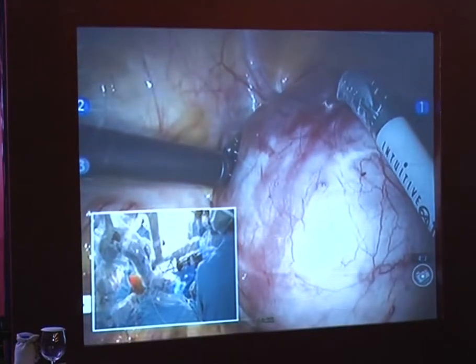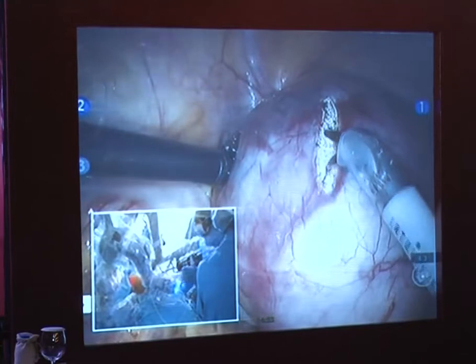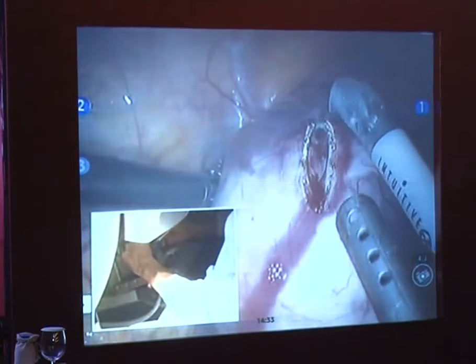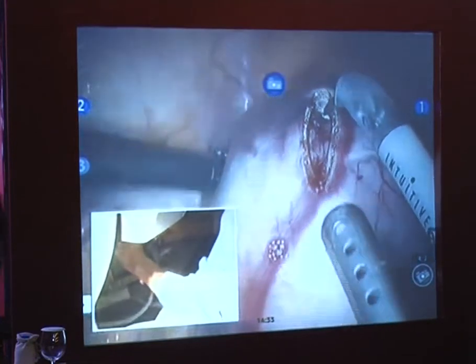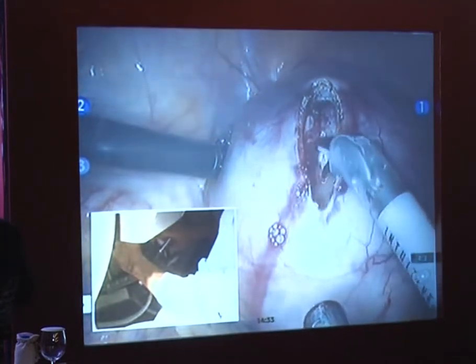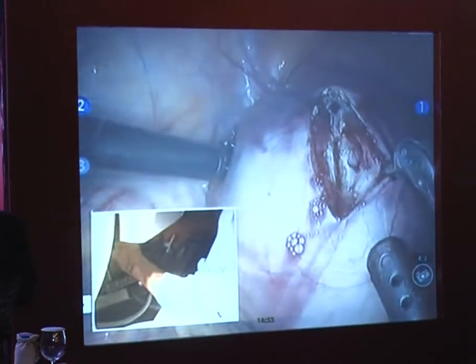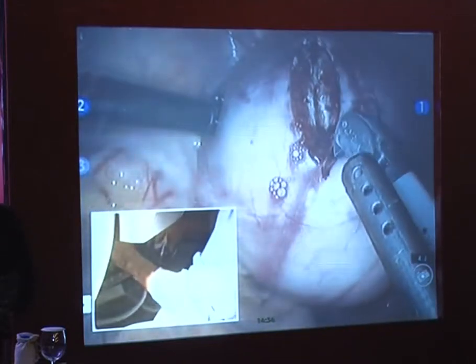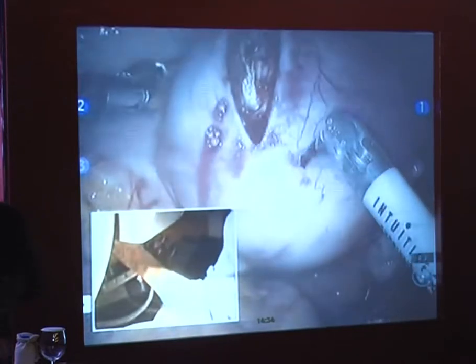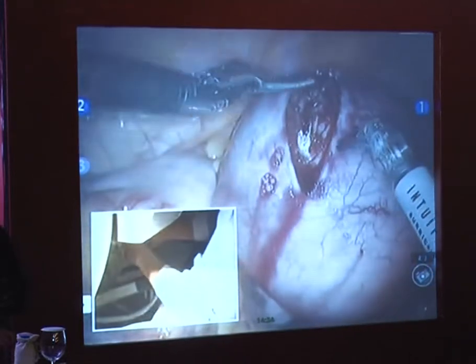Arnie, what are your power settings on your monopolar scissors, and are you using cut or coag? In this one, I'm actually using coag, but when you arc to the tissue like this and barely touch it with the scissor, it acts almost like cut, as you can see. And I'm staying away from the cornua here. And what is the setting on your monopolar? I usually like it at about 30. So the monopolar is set at 30 cut, 30 coag, okay.